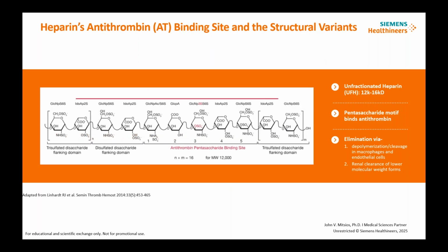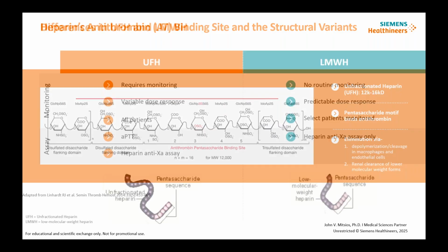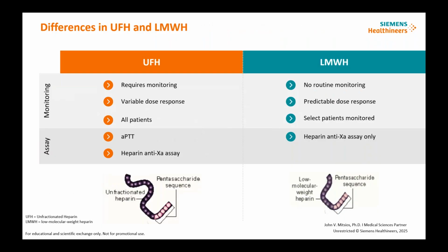So if we look at heparin, there's a unique characteristic on heparin: there is this antithrombin pentasaccharide binding site found on the heparin molecule, which facilitates the formation of that complex I just previously mentioned. So when we look at unfractionated heparin and low molecular weight heparin, the names obviously denote their major differences.